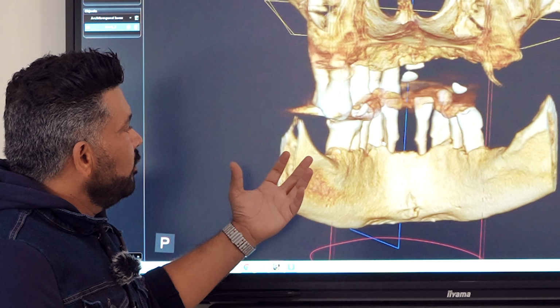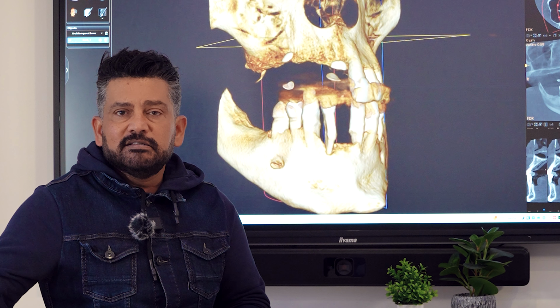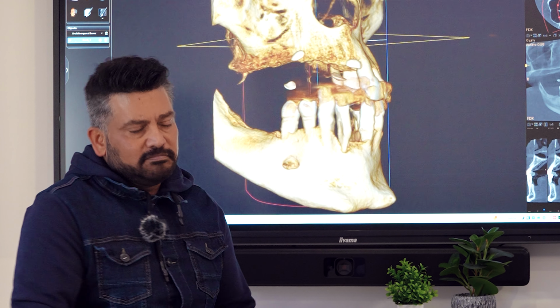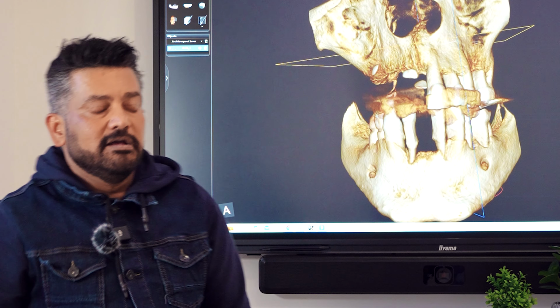When you have so-called gum disease, which is probably more bone disease, we call it periodontal disease, lay people call it gum disease. When teeth are moving, this is an indication of bone loss. And the bone loss can be quite aggressive, as you can see in this case. All this architecture is really important for us to visualize so we can avoid anatomical structures which will cause problems.